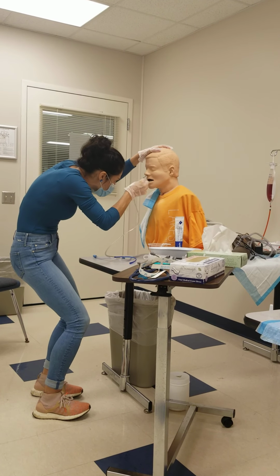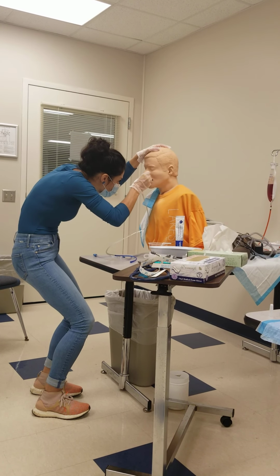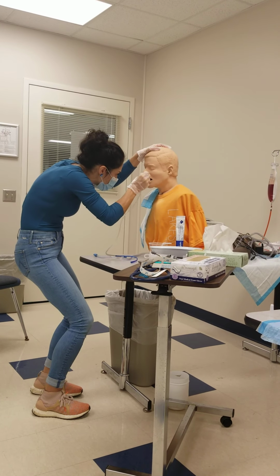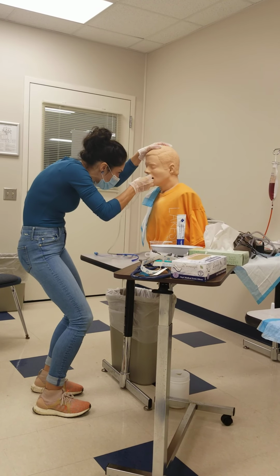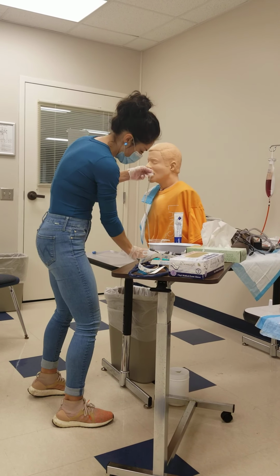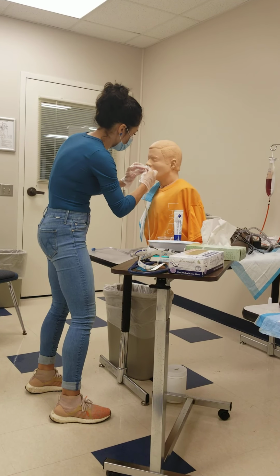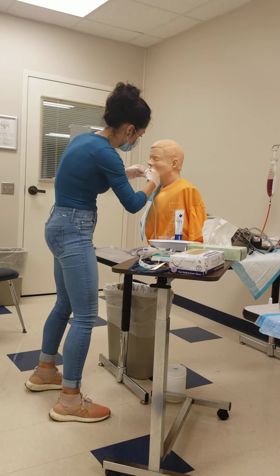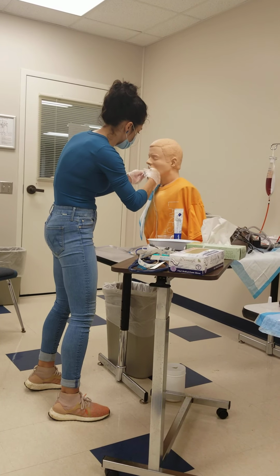Okay, so his head is forward, he's continuing to sip. Sometimes if the client's coughing, you can stop for a little bit and help them drink more water. Okay, and so now I've reached my point here. How are you doing, sir? So I'm trying to get my piece of tape here so I can secure it to the patient's nose.